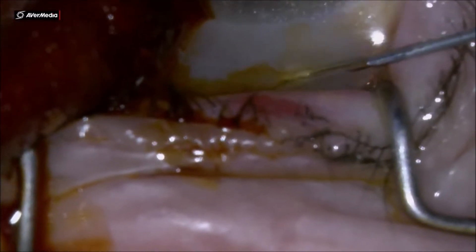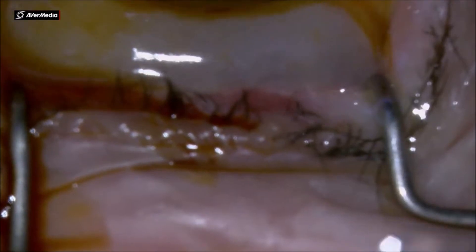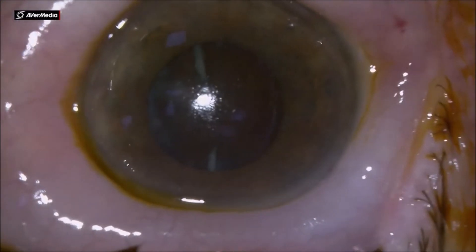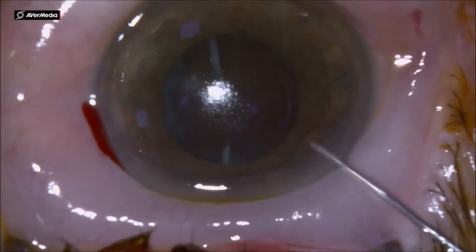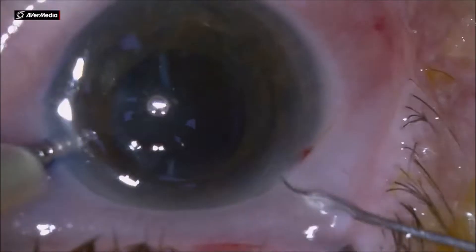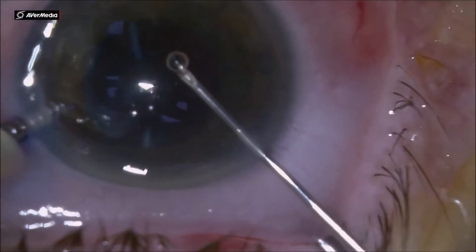Dear colleagues, this is another small pupil cataract. The nucleus is a little harder, a leathery one.